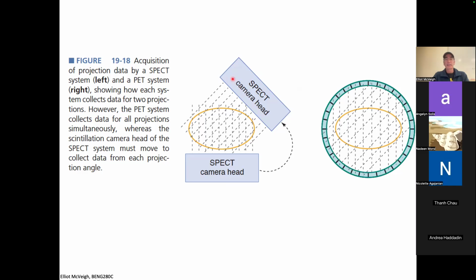So remember in the SPECT camera situation, we had a detector we rotated around the sample, and we were collecting lines of response for SPECT in basically a set of parallel directions for each orientation of the detector. So not very efficient, right? We're only detecting basically one projection per angle that we set this thing. It just sits there and we get that angle and then click it and get another angle. So all of the photons flying out in every other direction are being lost, right?